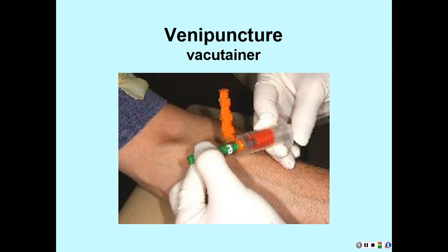Is it called the hub? Thank you, Jansel. It's called the hub, Jansel says. Thank you, sir. But you can reuse that, but you unsheathe the blunt end of the needle and screw that in, and then once you get your vein accessed, you push your tube up onto that needle, and it sucks blood into your tube.